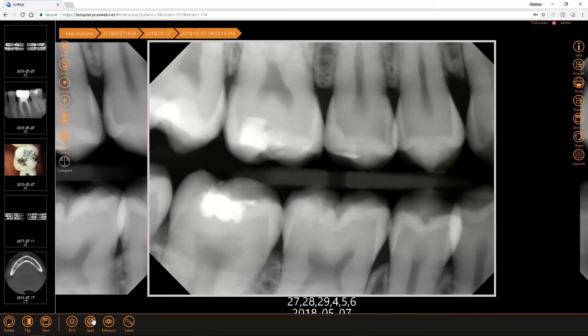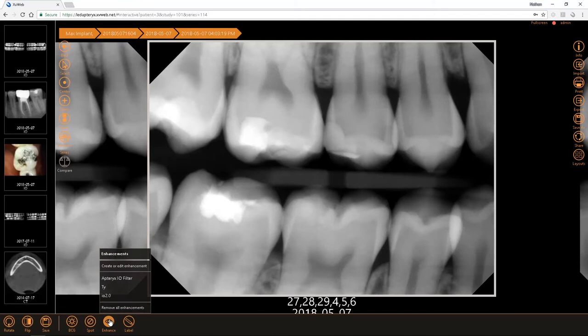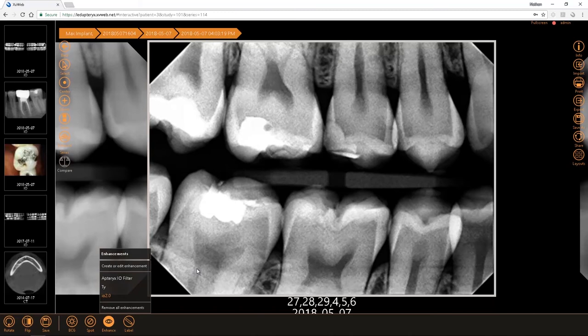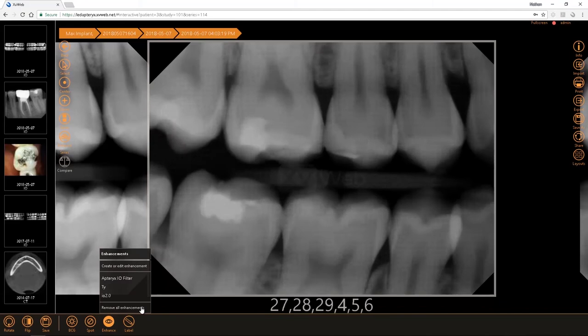The last tool I'd like to show you is our enhancement tool. This tool houses all the preset filters for specific sensors. Once in this enhancement tool you just select the filter that you'd like and it will apply it to the image desired. If you want to remove that enhancement you simply click remove all enhancements.